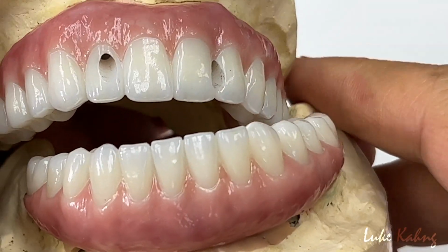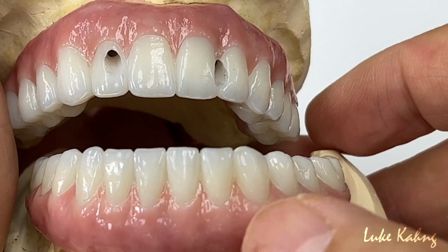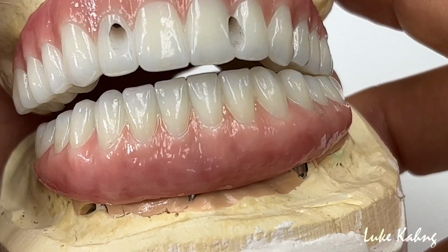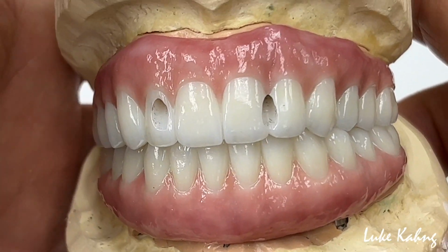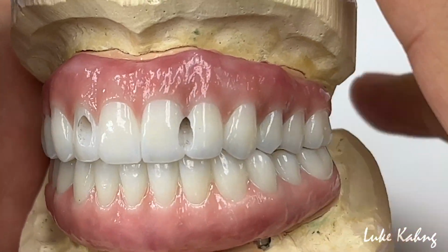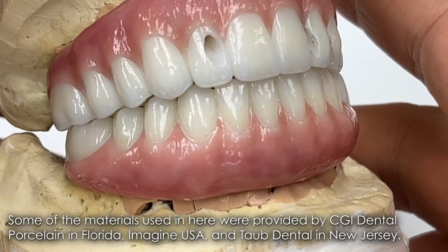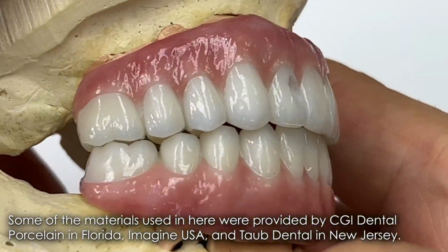Okay, this is the finals with the great highest aesthetics. It's facial contour, lip support, and the dentists are going to put some composite on top of that. It's more durable. There's a little bit of lack of hygiene, unfortunately.